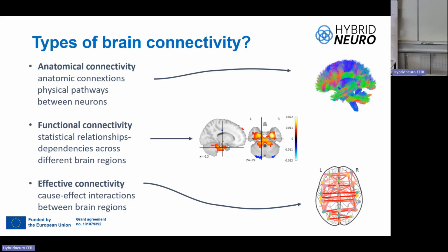Here we have the DTI image, what is the diffusion tensor image, with colors, the different regions related. Measuring the water flow from one side to another one, but not directly from the neuron's activity. I think it's useful, but the point is that we have billions of neurons. So this is a good approach, but it is not for me, because I work in the other one, so I prefer these other two.